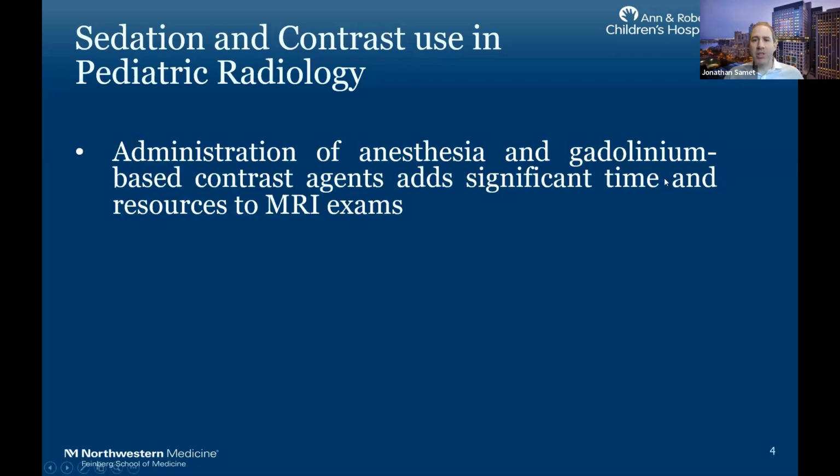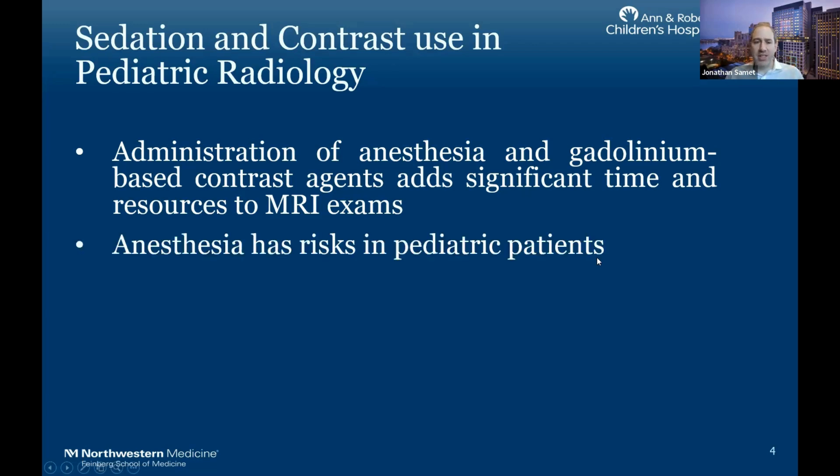In order to talk about that, I want to remind people about sedation and contrast use in pediatric radiology. As we know, the administration of anesthesia and gadolinium-based contrast adds a significant amount of time and resources to MRI examinations. Anesthesia, when you put a child to sleep, has risks.